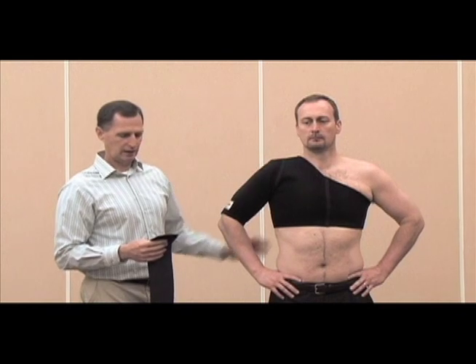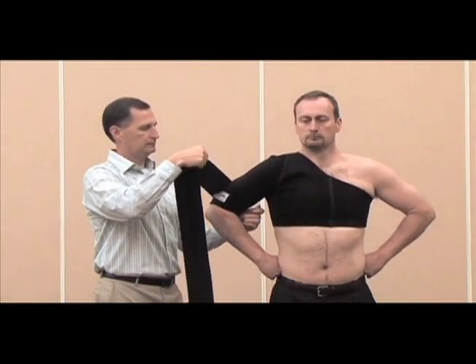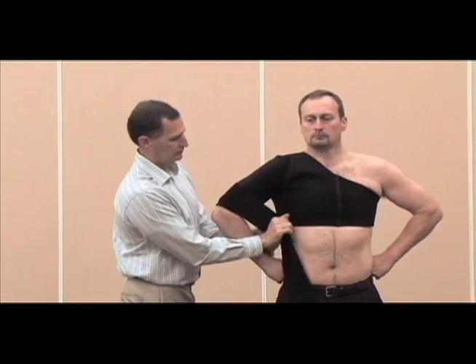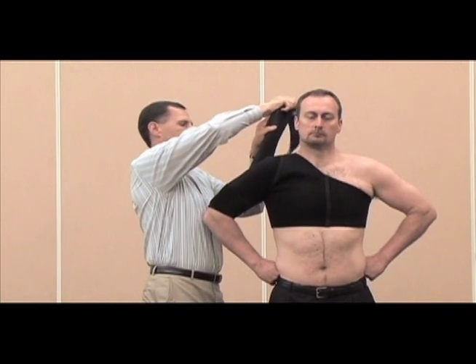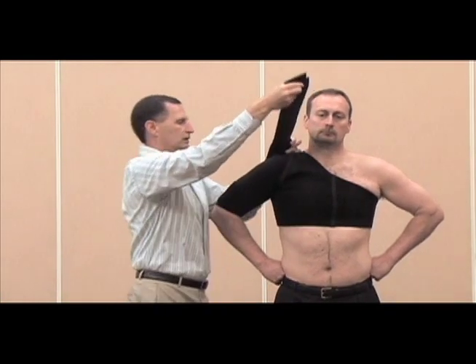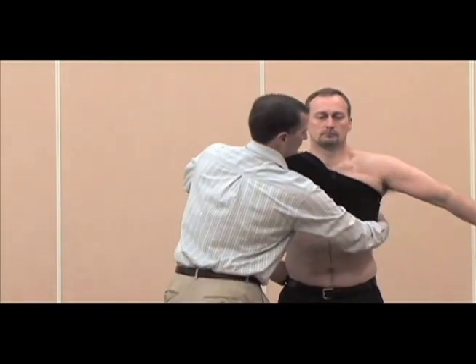If you run into an athlete that just has multi-directional instabilities — that can't decide if they want to sublux anteriorly or posteriorly — the Soli offers a multi-directional fitting. Start just below the bicep with one of the four-inch straps, around and under the armpit, up over the top of the shoulder. Take your most stretch out of the strap and secure it underneath the opposite arm.